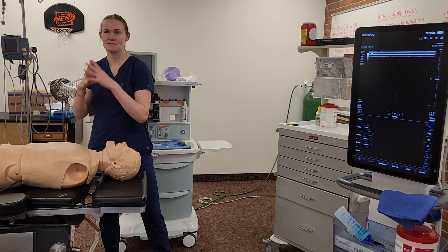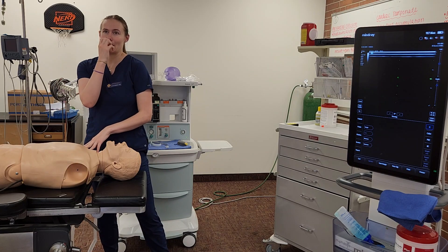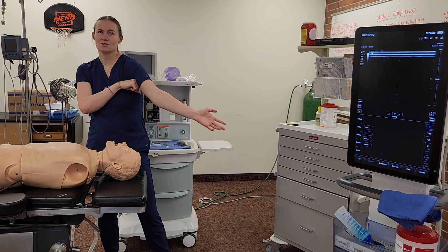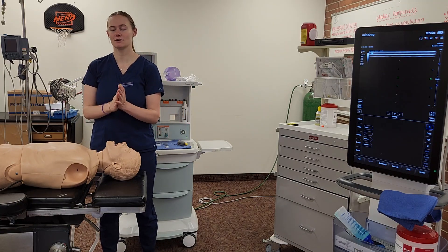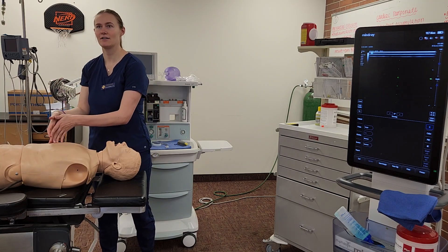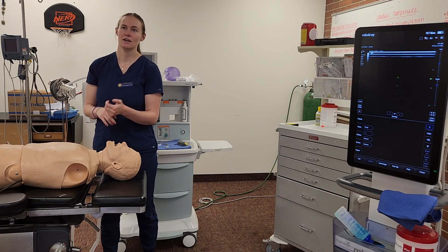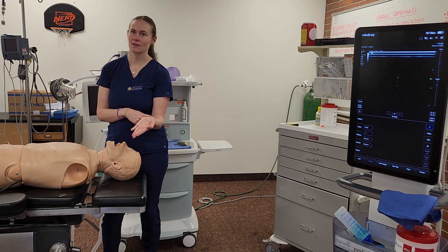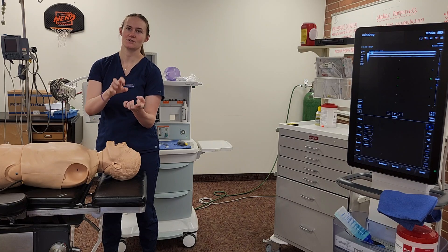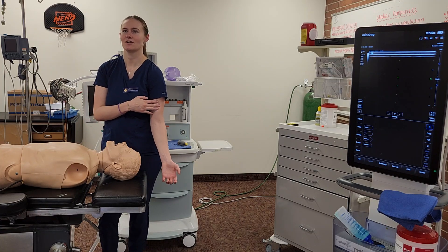My sterile needle advancement angle, once I identify the landmarks, is inserted shallowly one to three centimeters in-plane, anterior to posterior relative to the axillary artery. All needle redirections are done through the same insertion site through the skin wheal we made. If using a nerve stimulator, the optimal reading is 0.4 milliamps, but between 0.3 and 0.5. If you're less, you're probably in the nerve; if more, you're too far away. For the ulnar nerve, you'll see thumb adduction. For the median nerve, two to three fingers will start flexing. For the musculocutaneous nerve, you'll have bicep flexion. For the radial nerve, you'll have triceps extension.